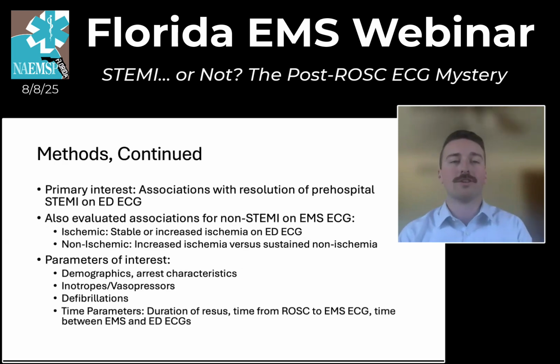Our primary interest in this study, as I mentioned, was looking at associations with resolution of a pre-hospital STEMI on subsequent emergency department EKGs. But we also looked at associations for non-STEMI out-of-hospital classifications as well.